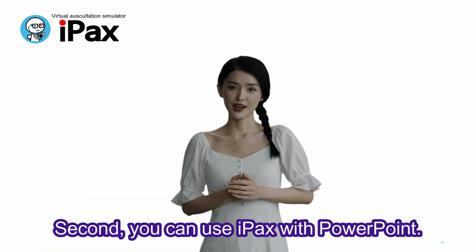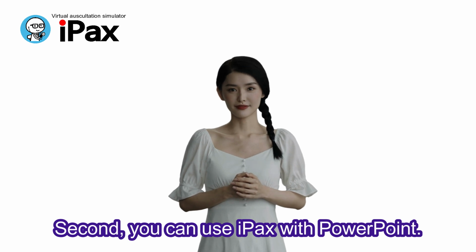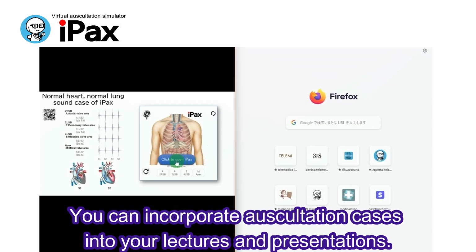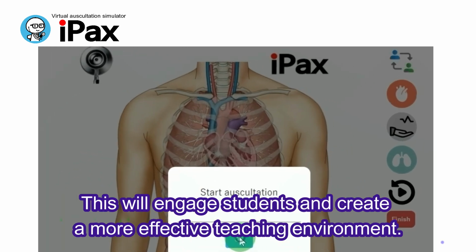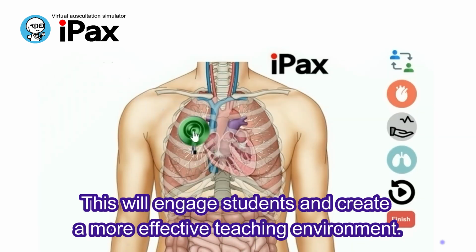Second, you can use iPax with PowerPoint. You can incorporate auscultation cases into your lectures and presentations. This will engage students and create a more effective teaching environment.